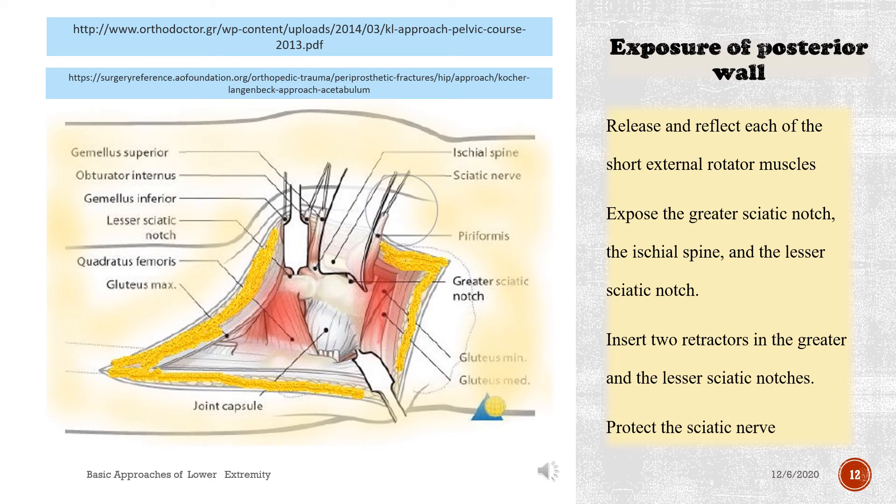Exposure of posterior wall: release and reflect each of the short external rotator muscles. Expose the greater sciatic notch, the ischial spine, and the lesser sciatic notch. Insert two retractors in the greater and the lesser sciatic notches. Protect the sciatic nerve.